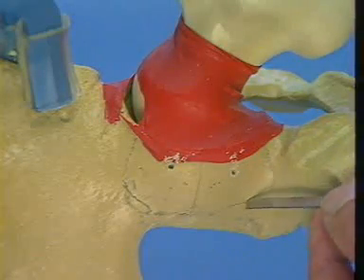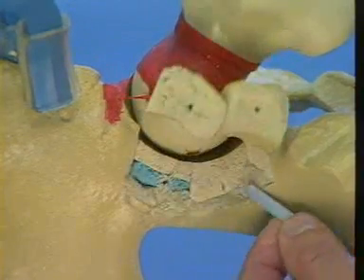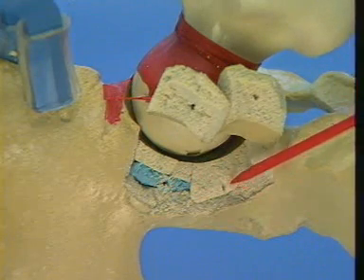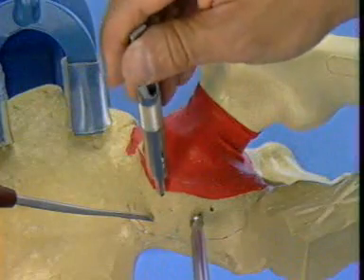After drilling both holes, it's often advisable and quite instructive to redisplace the fragments of the posterior wall in order to make sure that the screws will be outside the joint. The depth of the holes is measured.